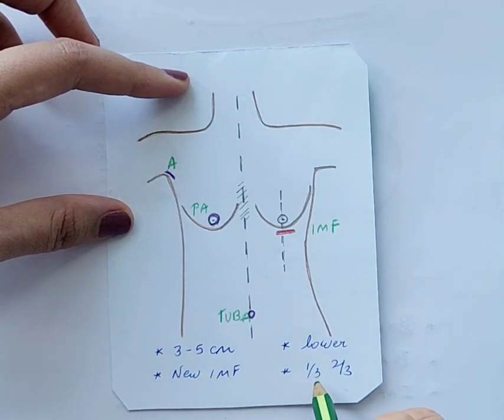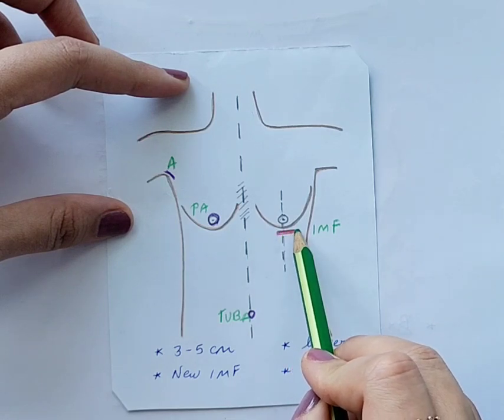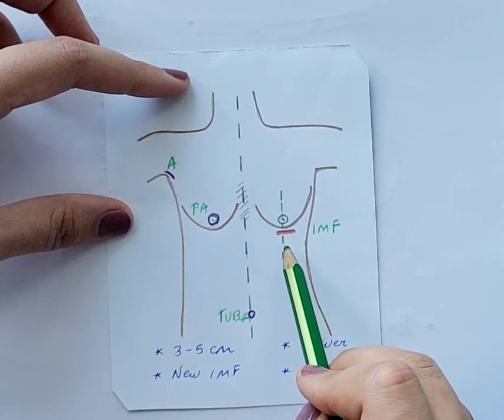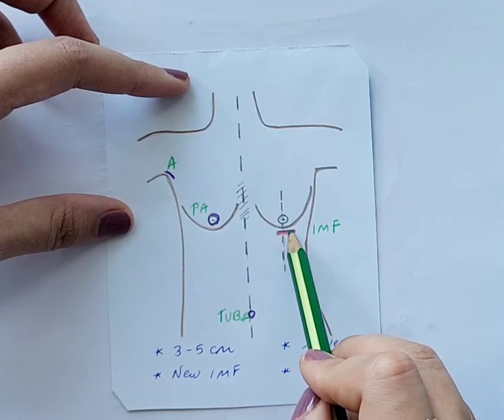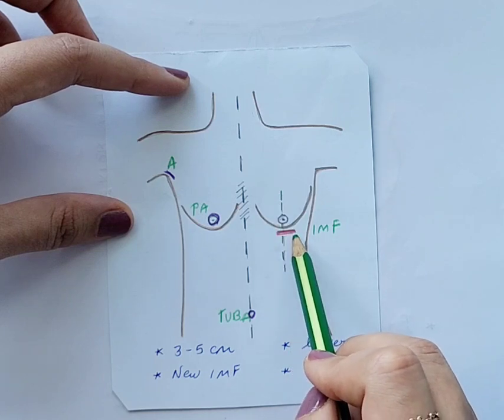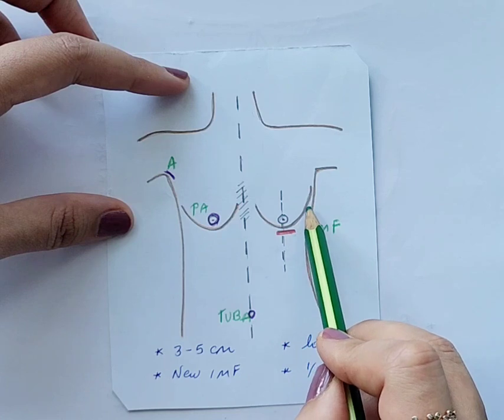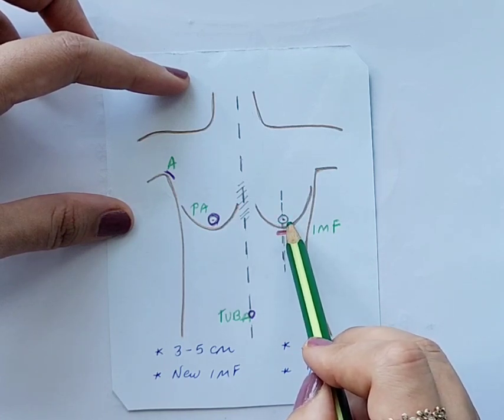Now, this incision is also placed in a 1/3, 2/3 manner. That is, if you consider an arbitrary line across the nipple area, 1/3 of it is on the medial part and 2/3 lateral. This is to reduce the show of the incision as much as possible. As the maximal breast tissue will be in this region, it will easily cover this scar.